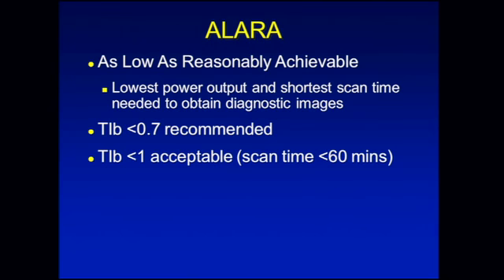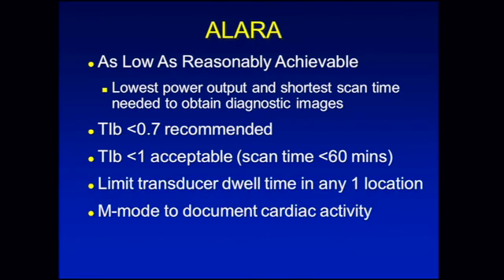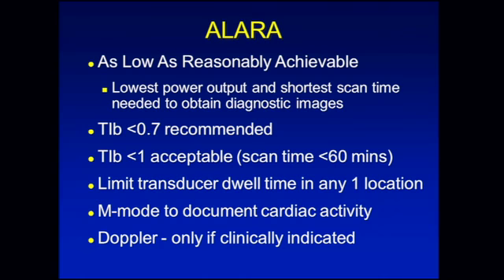Less than 1 is acceptable if the scan time is limited to less than 60 minutes. We should also limit the transducer dwell time in any one location as much as we can. Use M-mode or video to document cardiac activity, and Doppler should only be used if clinically indicated.